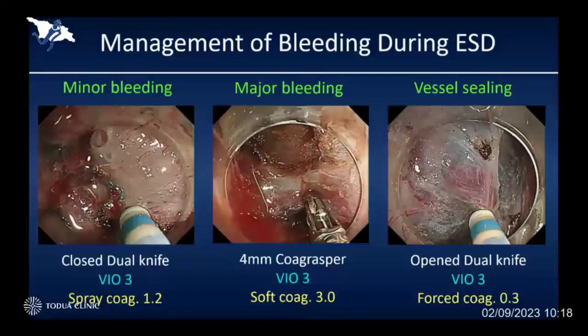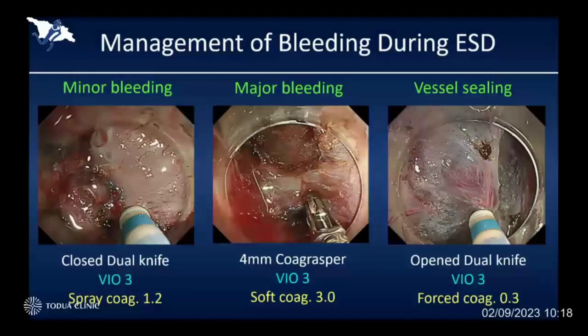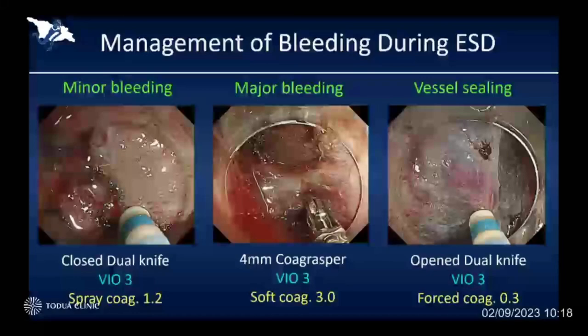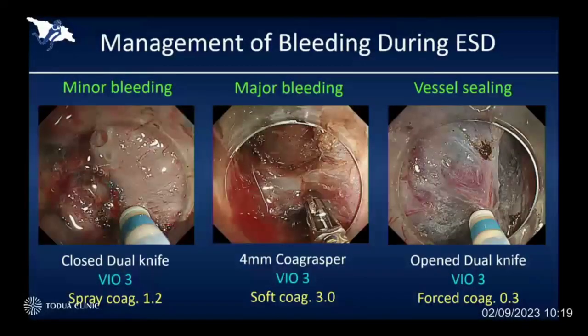Another difficult situation is severe bleeding during a long-lasting ESD procedure. But for most minor bleeding, we can easily stop it by applying the closed tip of the dual knife. By the way, the dual knife is my original device, developed together with Olympus. We can use it for making marking, for mucosal incision and submucosal dissection, and for hemostasis — a multi-functional device very convenient for colorectal ESD. We can easily stop minor bleeding by using the closed tip of the dual knife with spray coag setting 1.2.